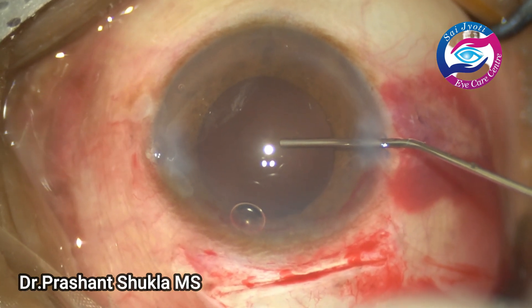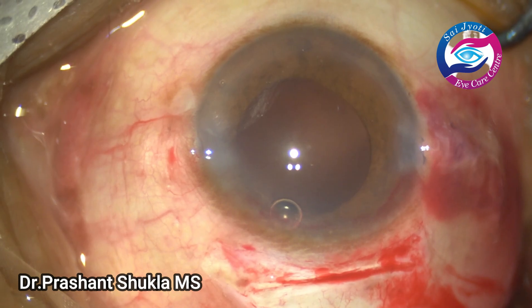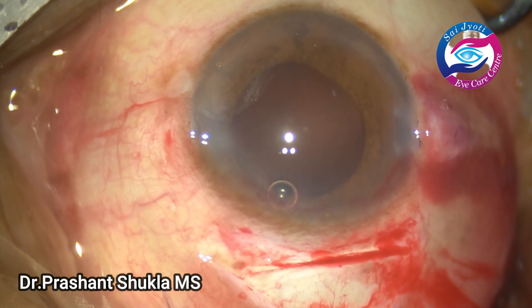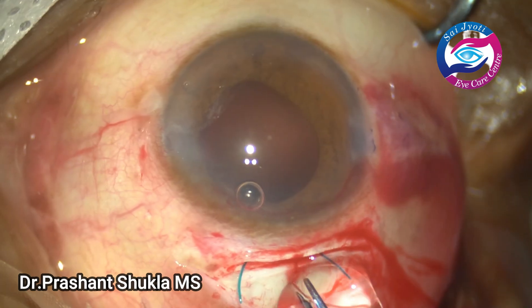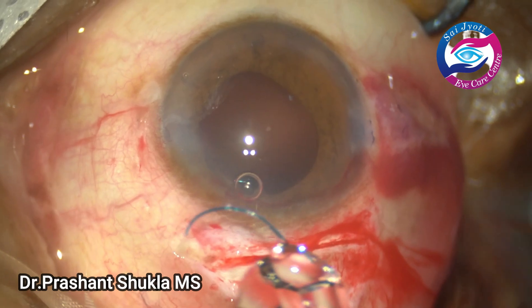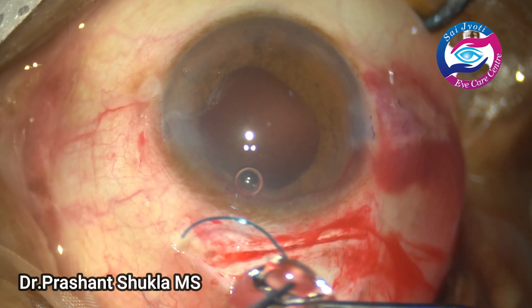Here I am filling the capsular bag using sodium hyaluronate 1.4. I have planned to implant a 3-piece hydrophobic aspheric intraocular lens — a monofocal one.